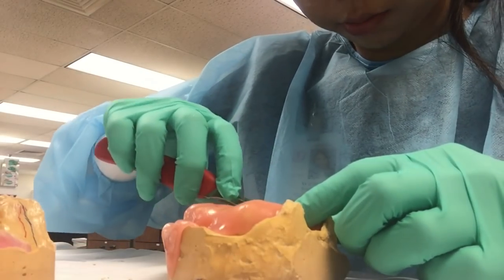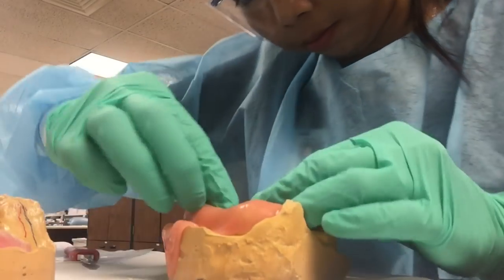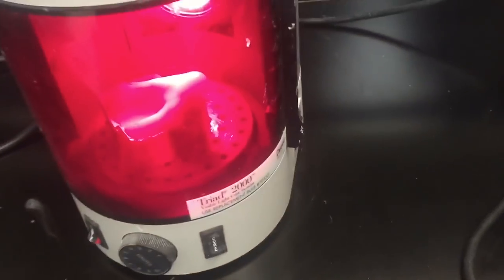Then I'm using a blade to cut it out, making sure to cut on top of that red line. Here is what it looks like. I also created a handle, and then I'm placing it in the light-cure machine — it reminds me of a little microwave, but it's actually more like a little carousel.